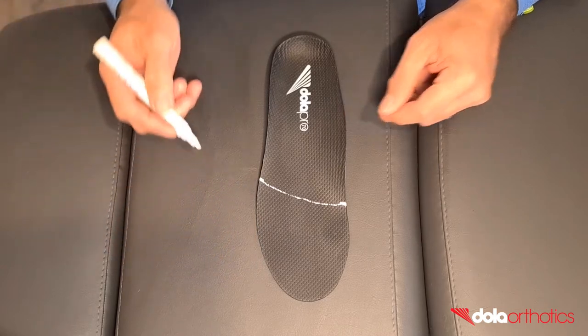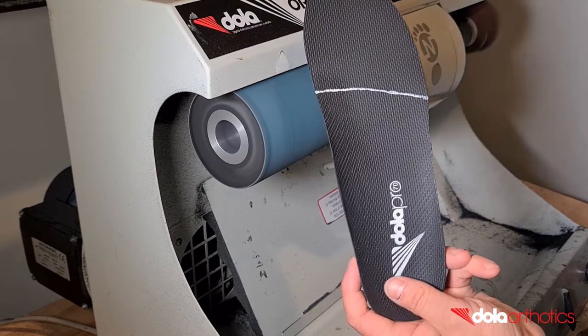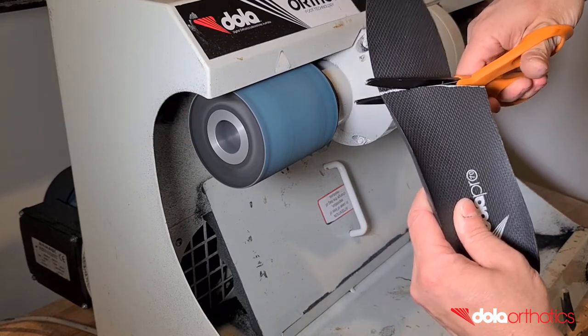You now have your three-quarter length marked as a guideline for grinding. The aim of grinding is to remove the orthotic shell material anterior to your guideline. Using scissors, remove the bulk of the extension following the curve of your grinding guideline.